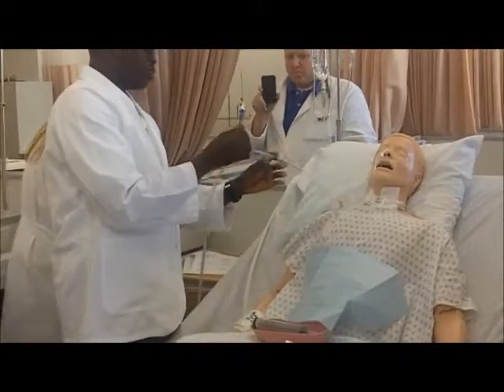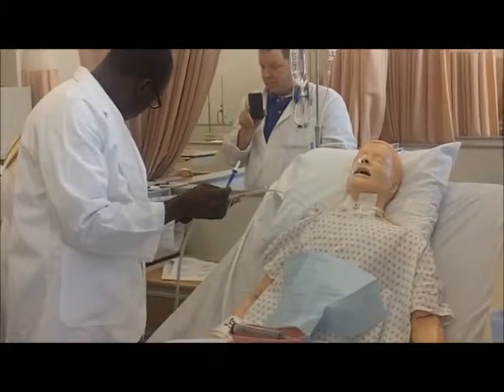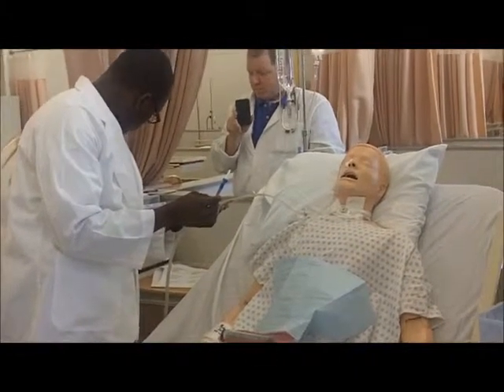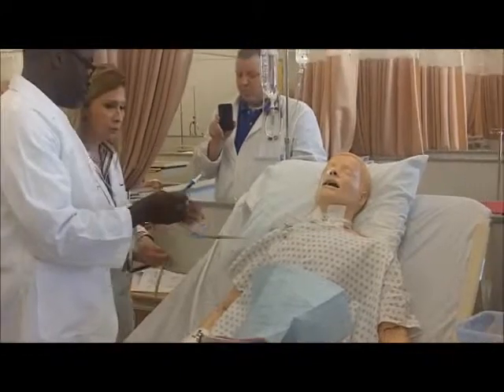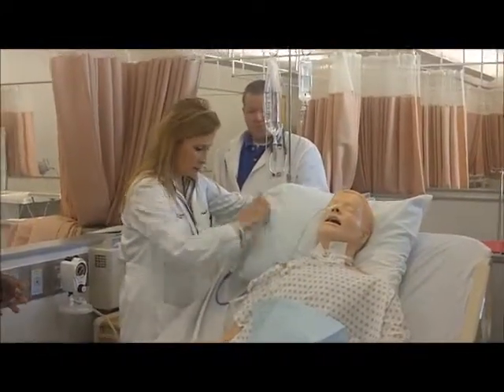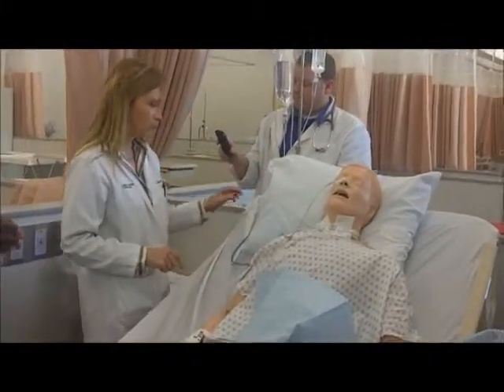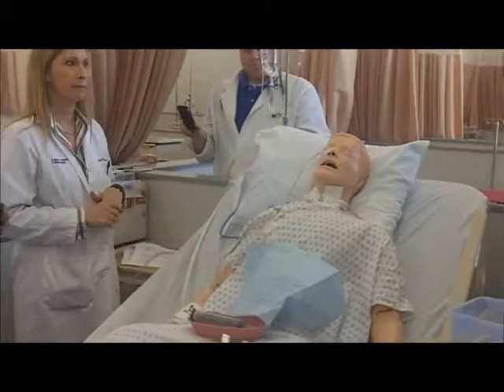Okay, and then we can turn this on to intermittent. This one's really not gonna work because I showed you there's a crack on it, but some of the other ones will work. Normally what I do, I put it like this so that it's not tugging when the patient moves around, so it's out of the way.